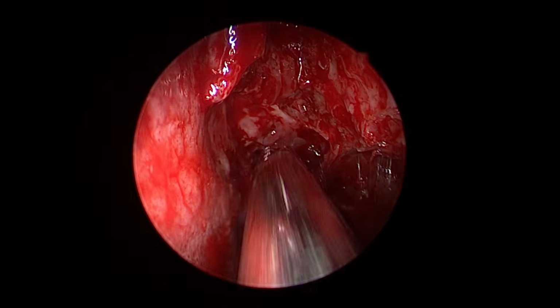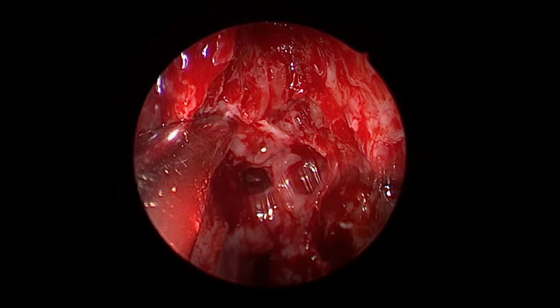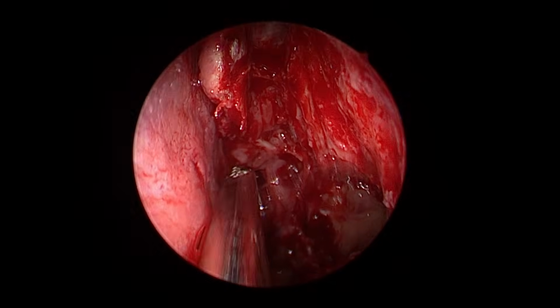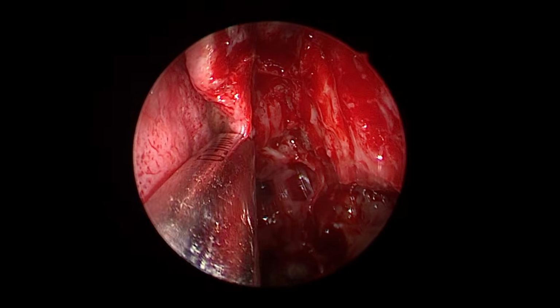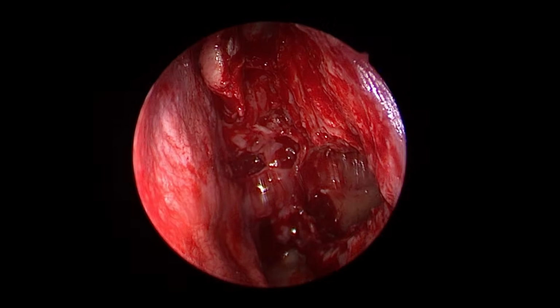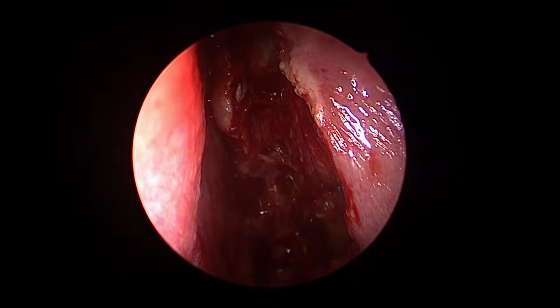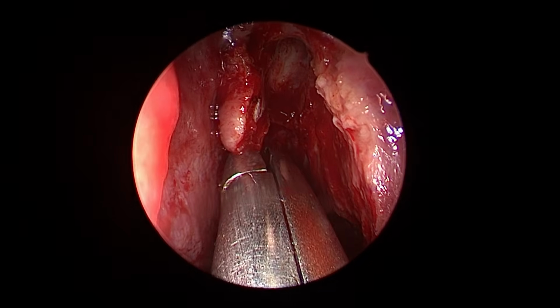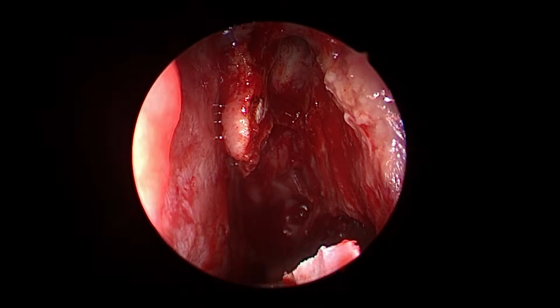See now, the reason is you don't have to go up, because the sphenoid sinus ostium is closer to the roof than the floor. So make sure that you don't go higher up. Otherwise you may breach the skull base.